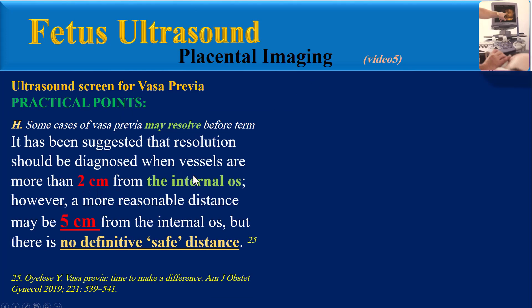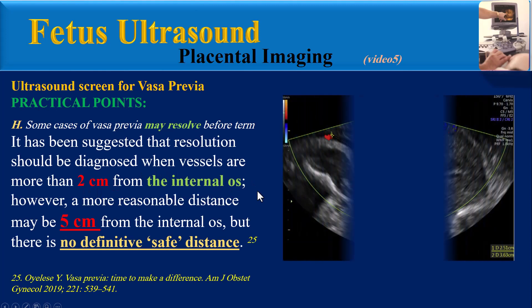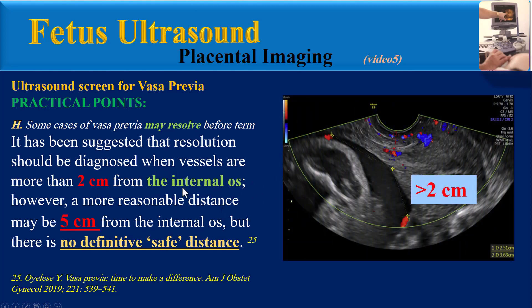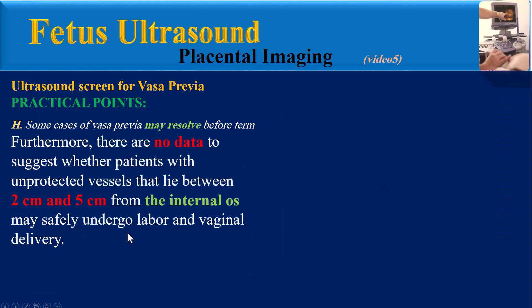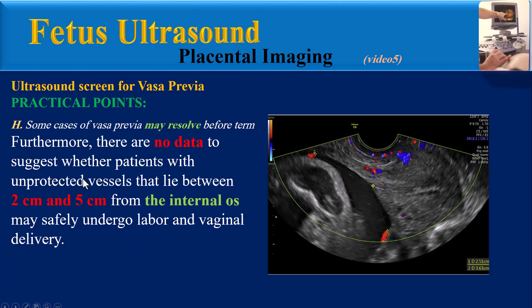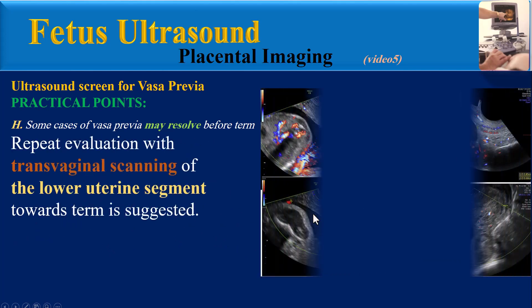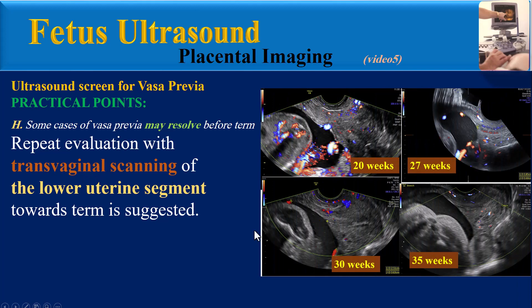An image at 35 weeks gestation shows complete resolution of Vasa Previa from the lower uterine segment. It has been suggested that resolution should be diagnosed when vessels are more than 2 cm from the internal os; however, a more reasonable distance may be 5 cm, though there is no definitive safe distance. There are no data to support whether patients with vessels between 2 and 5 cm from the internal os may safely undergo labor and vaginal delivery. Repeat evaluation with transvaginal scanning towards term is the best recommendation.